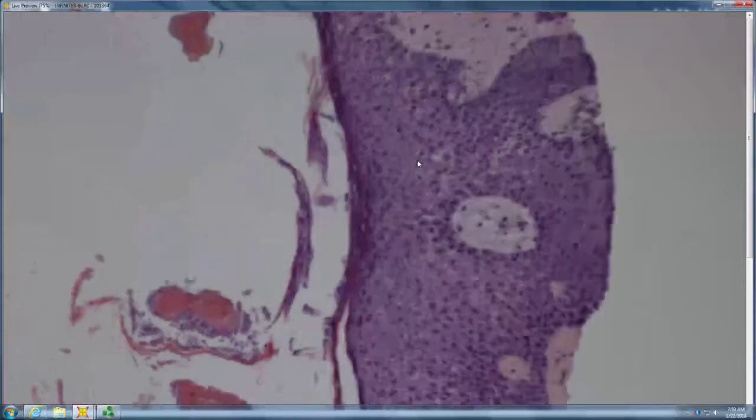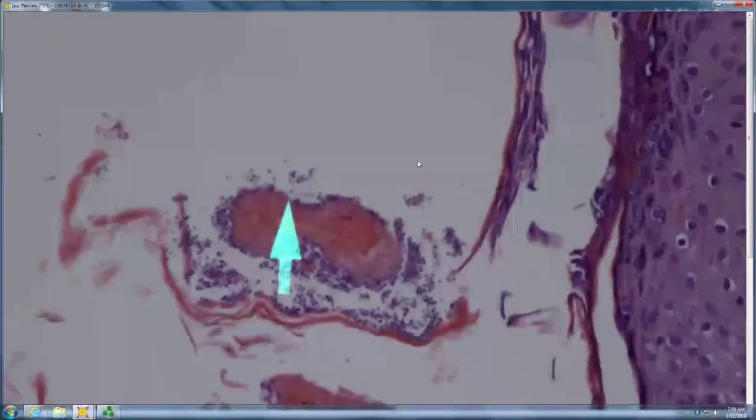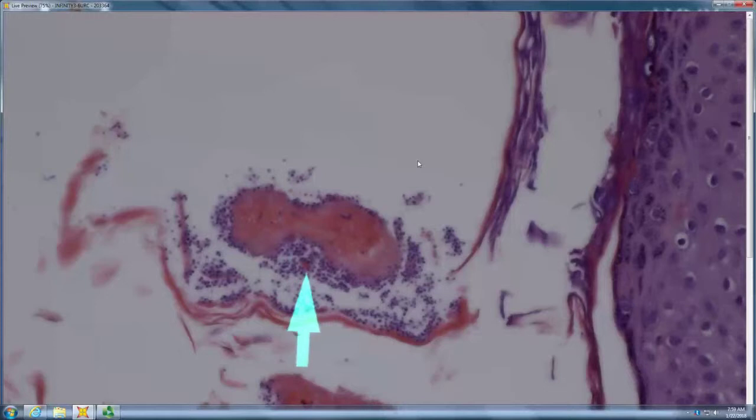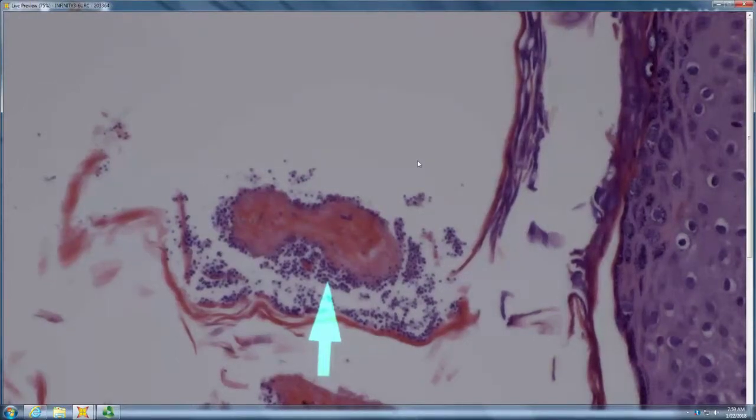Okay, so that's hair shaft. That's what's left of the hair. Where are the spores? Inside or outside? They're outside, so some ectothrix. So it's a large spore ectothrix. What's your usual small spore ectothrix? Your usual one. No, that's small spore ecto.